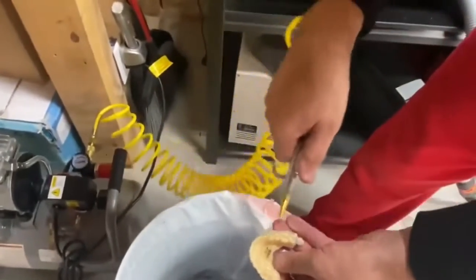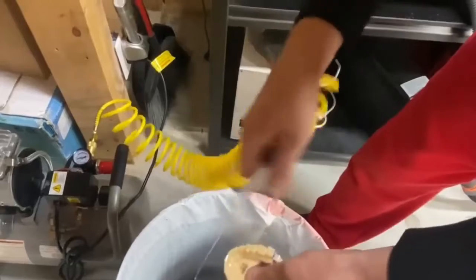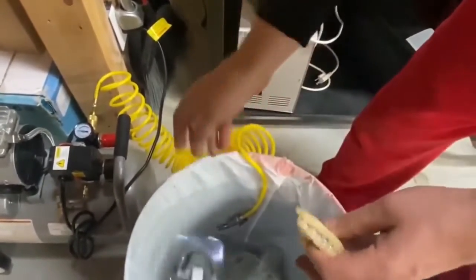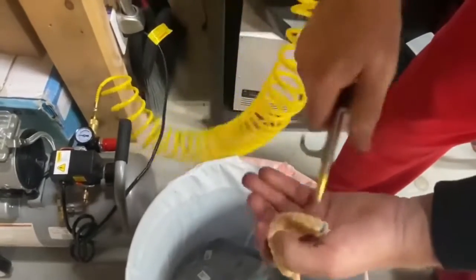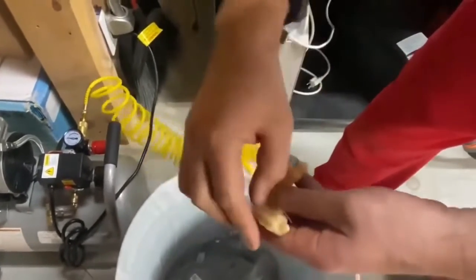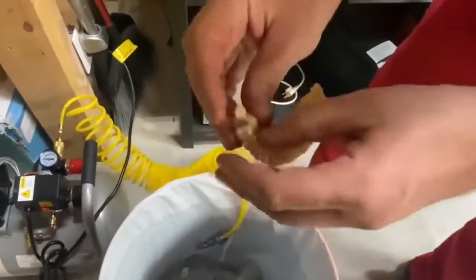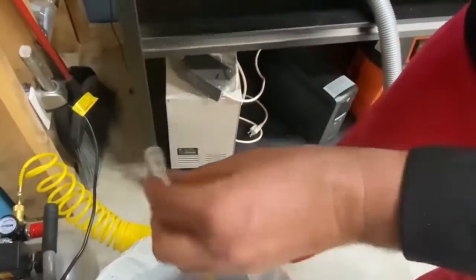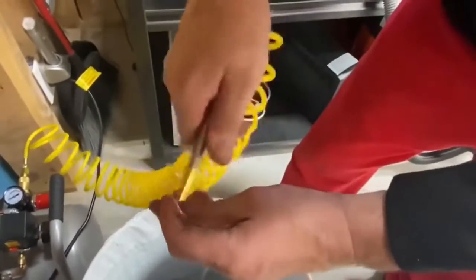I'm just going to blow a little bit of oil. I can remove the bottom portion fairly easily. Blow it again. And we're going to remove this aligner, very gently. I'm going to blow it off and show you how it's done.